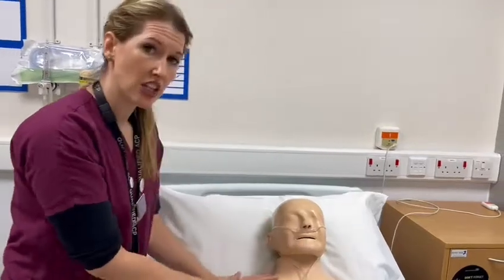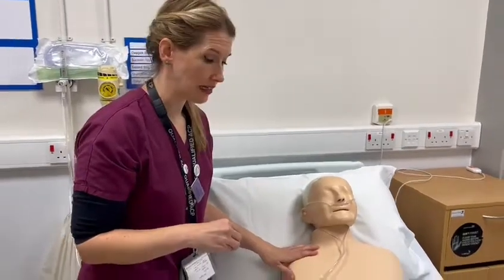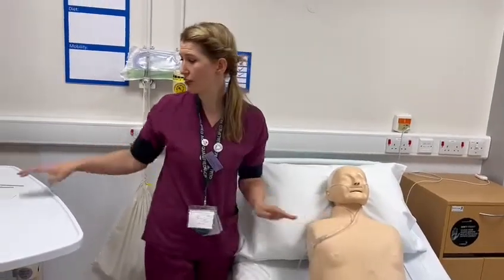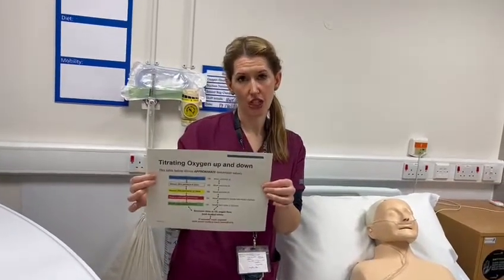So once I've made that change, just because things can change, I would then go and just check that their SATs are within their target range as predicted. And you can change, so the flow rate can go up to probably about 6 litres, but you do have this flow chart to prompt you if you are worried about the conversions, which you will find on your machines.